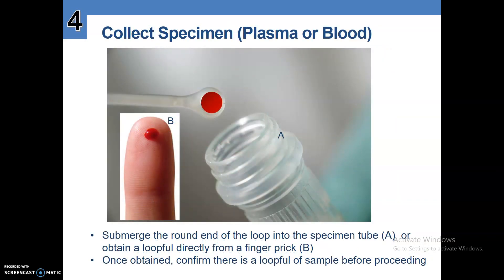Number four, collect the specimen. This can be plasma or blood. Submerge the round end of the loop into the specimen tube — that is option A. Or obtain a loopful directly from the finger prick — that is option B. Once obtained, confirm there is a loopful of sample before proceeding.